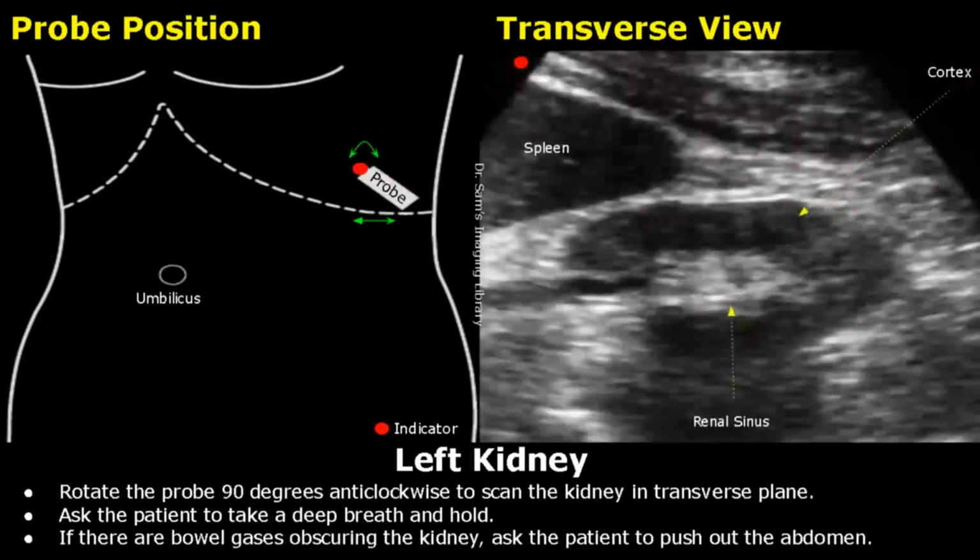Next, rotate the probe 90 degrees anti-clockwise to scan in transverse plane. Using the same breath hold technique, we will get a transverse view of the left kidney. We can see the spleen here. This is the renal cortex with hyperechoic renal sinus in the middle.